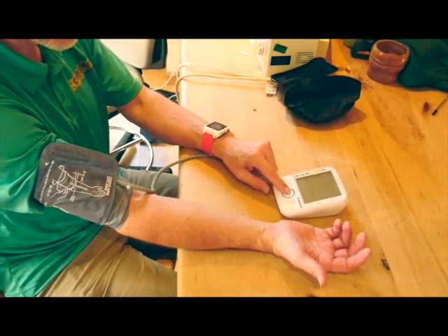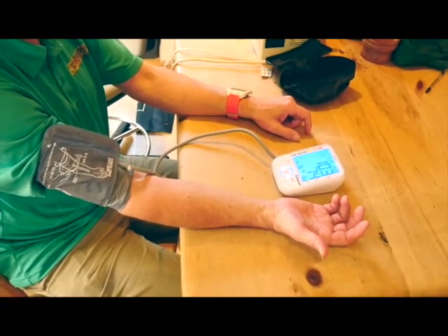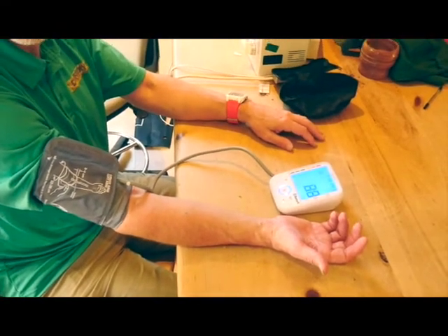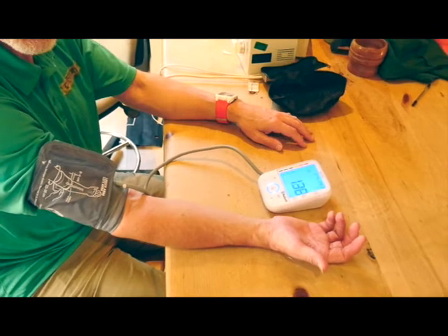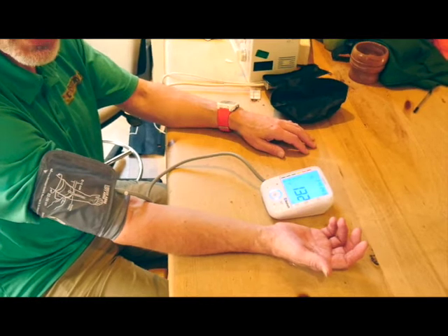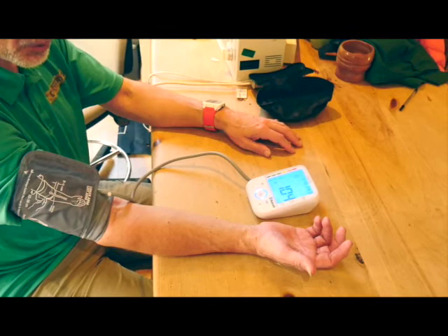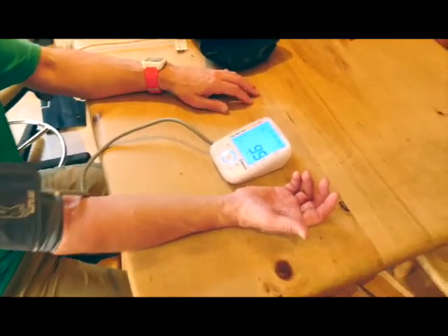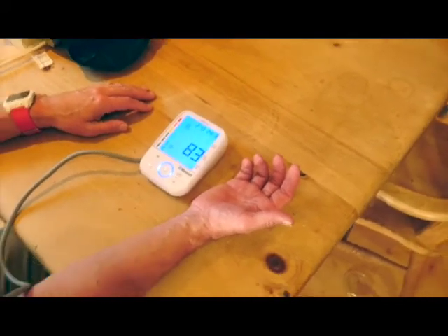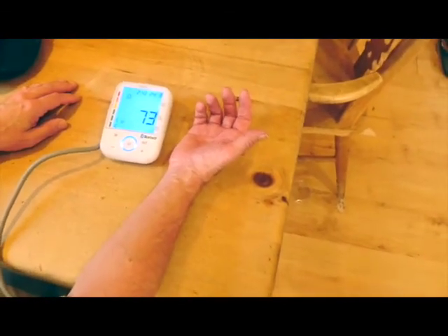Your hand nicely relaxed at about heart level. You've rested for about a minute and then you turn on the machine. It starts to blow up and you can hear a noise and feel it beginning to squeeze at the upper part of your arm. Sometimes it'll stop and start. Then as it's dropping down, you'll start to feel your pulse in your upper arm. It gradually comes down — takes about a minute.